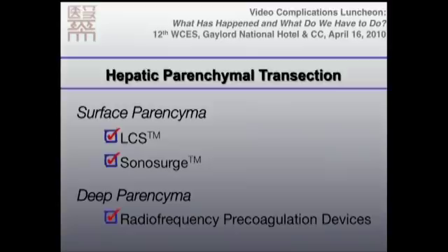Parenchyma transection is the most important procedure for laparoscopic liver resection. For surface parenchyma we can use ultrasonic coagulators. For deeper parenchyma we better use an ultrasonic tissue dissector along with radiofrequency precoagulation devices.